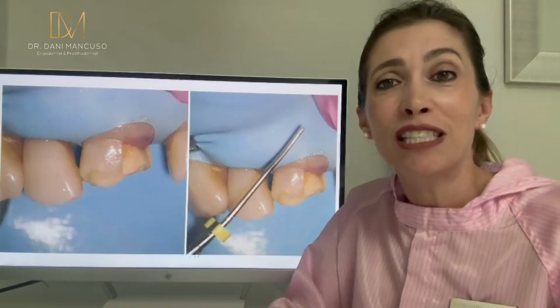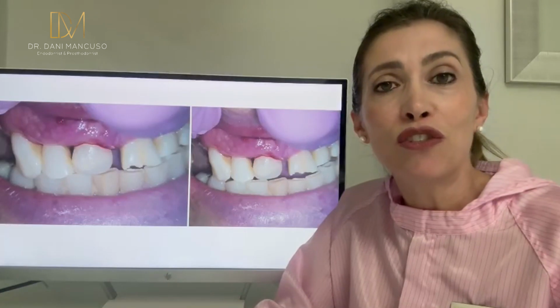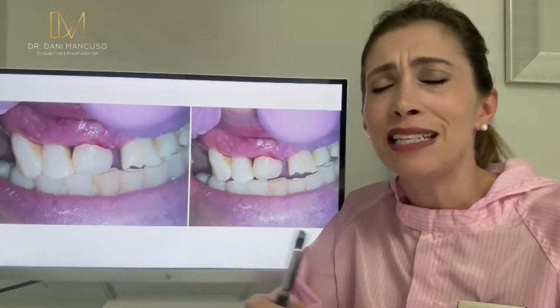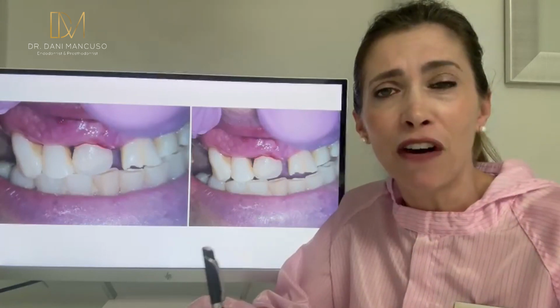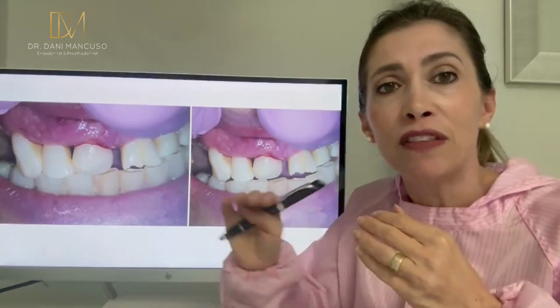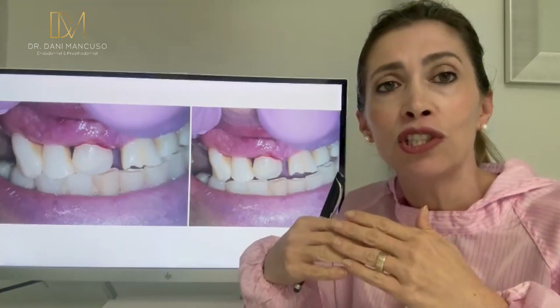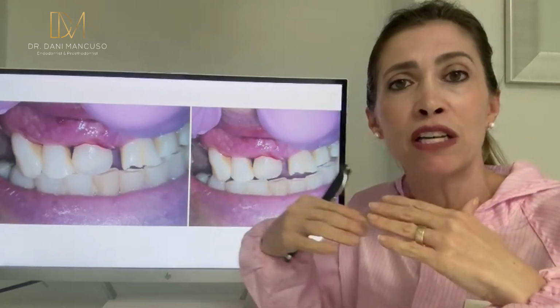You can use the hot tip again to remove that granulation tissue so you can build the tooth with composite. It doesn't need to be perfect. You are not there to do the cosmetic, the final work. Don't put pressure on yourself. You just want to give the guidance on occlusion, stabilize the occlusion, give guidance on protrusion and lateral excursions.